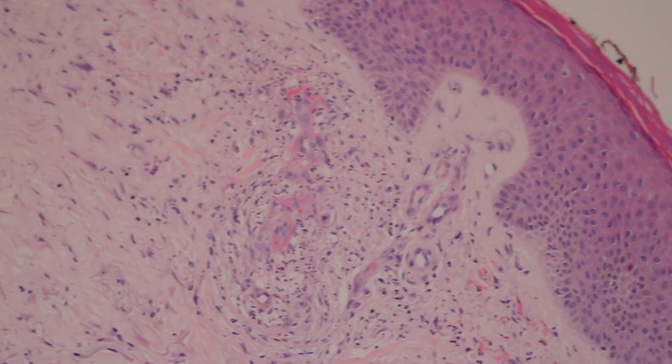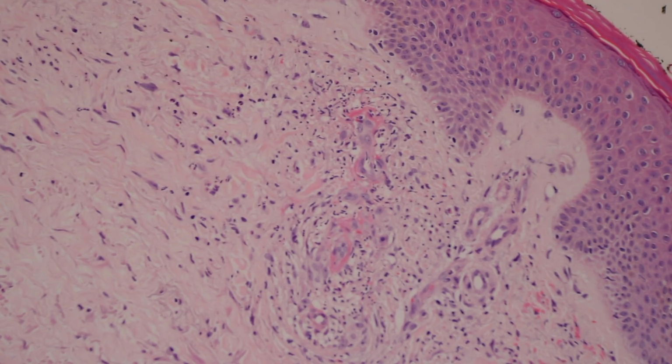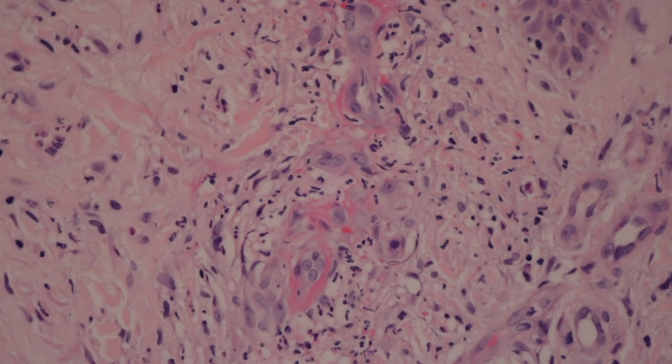And also look up here, what do we see? Leukocytoclastic vasculitis. Here's where it starts. It starts with a vessel, fibrin around it, neutrophils, neutrophil debris. So we're back to where we started at the beginning of the video.